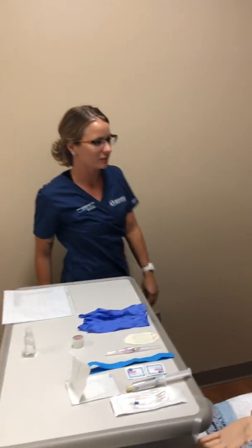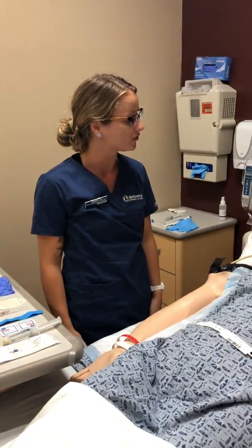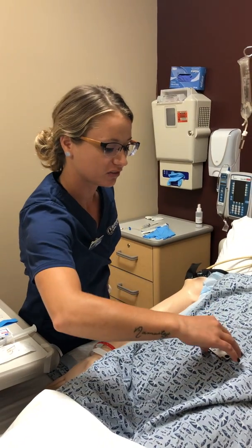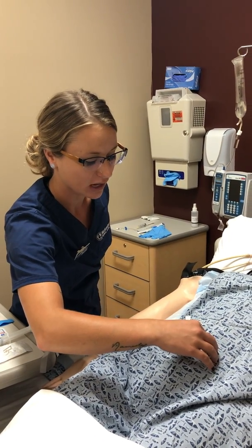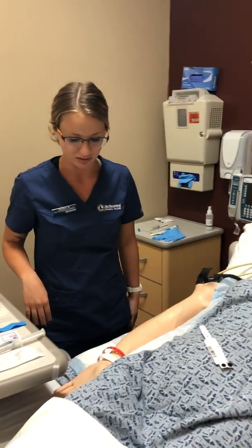Good afternoon. My name is Jenny. I'll be your student nurse today. Can I have you please tell me your full name and date of birth? And she tells me Mary Smith, date of birth 5/18/1963. Armband matches up. I have the right patient.